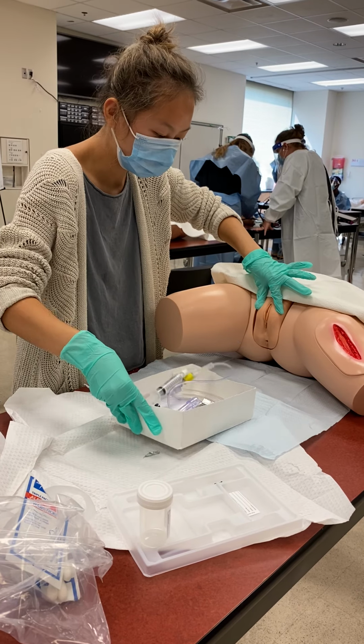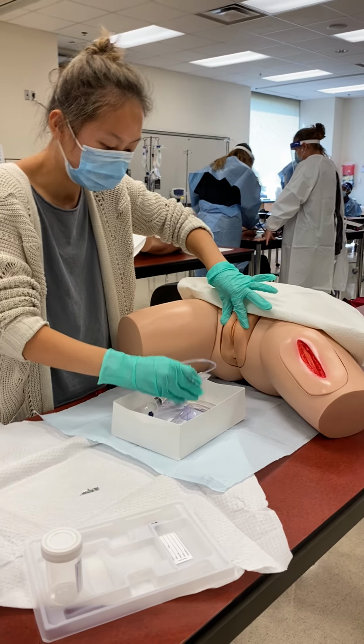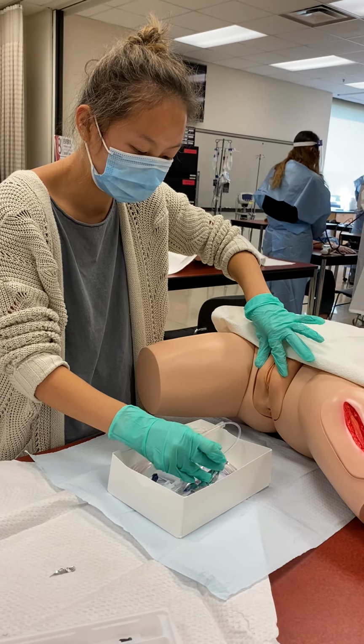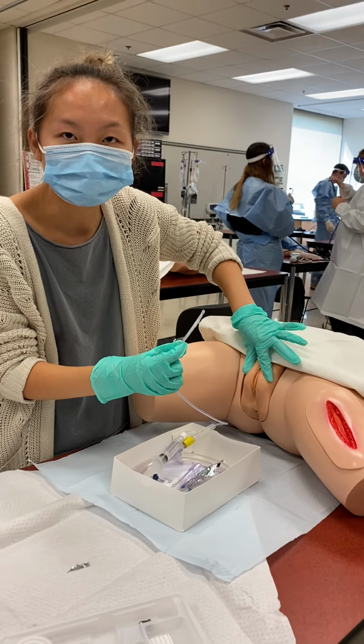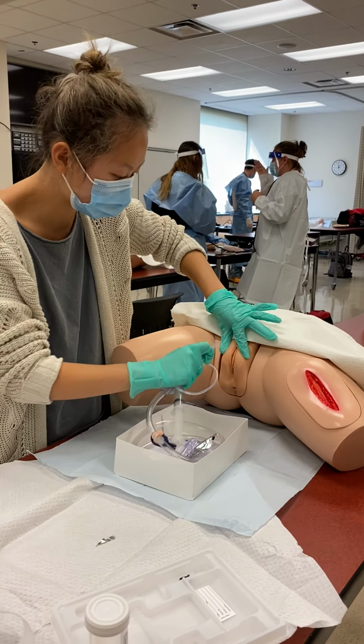So we want to make sure this kit is close to our working reach, and so we can take this tip out of the lube now. And so I want to tell the patient to take in a deep breath because they might feel a little bit of pressure while we insert this.